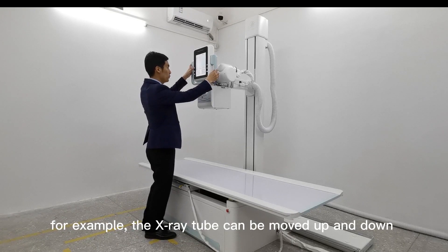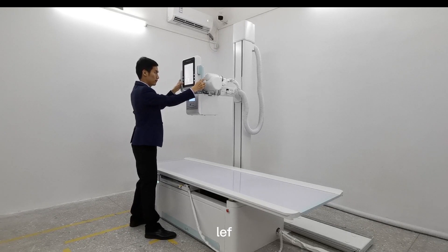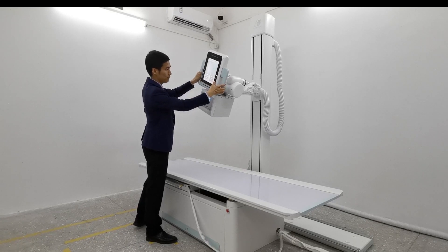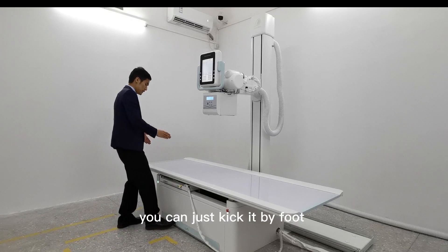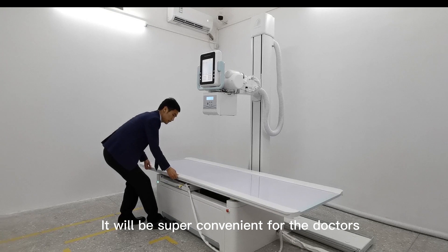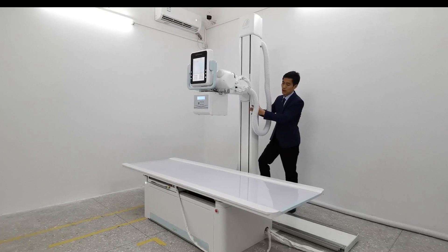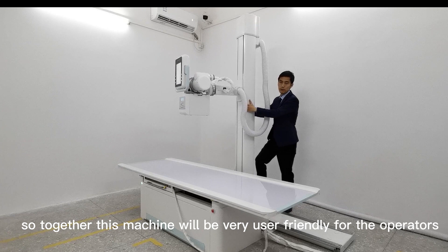For example, the X-ray tube can be moved up and down, left and right, and you can also rotate it to 45 degrees. Also, the table surface is 4-way floating and is electric — you can just rotate the knob. This makes it simple for doctors to see images from every angle and every position. The two columns can also be rotated 180 degrees, making this machine very user-friendly for doctors.